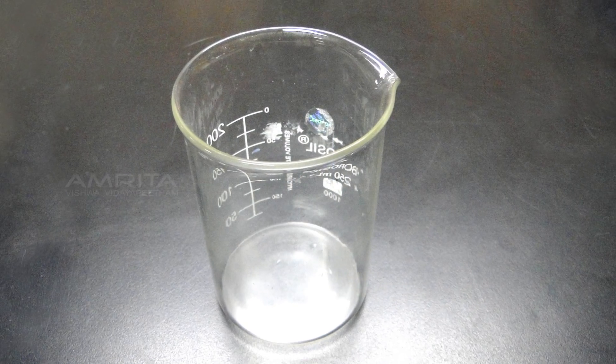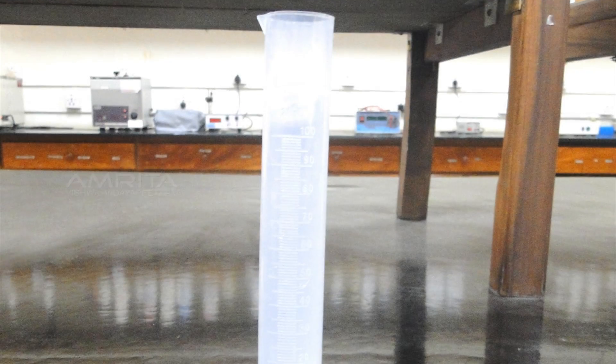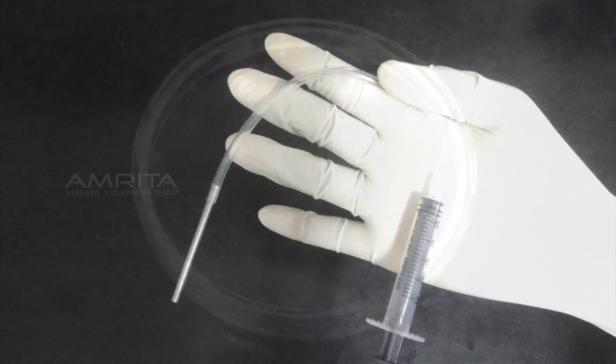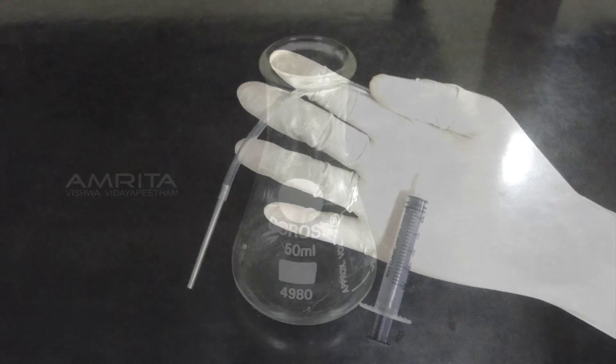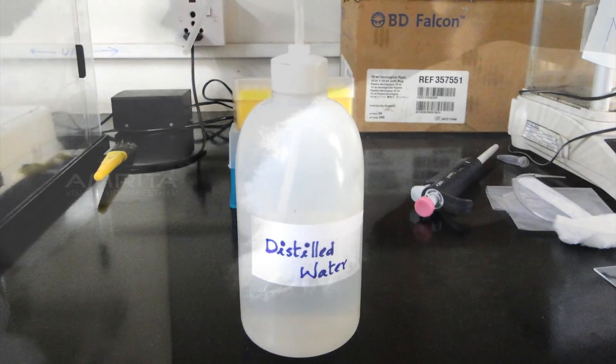Additional materials: beaker, 0.5 mL vials, measuring cylinder, petri plate, gel punch with syringe, conical flask, distilled water, and cotton.